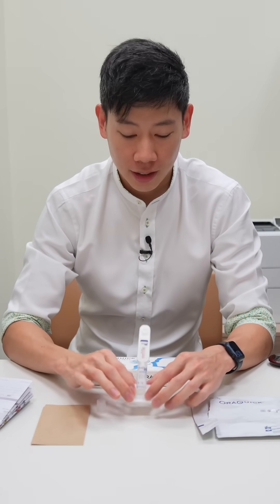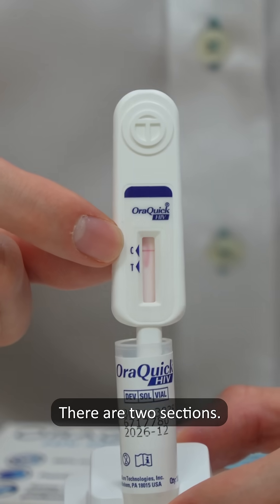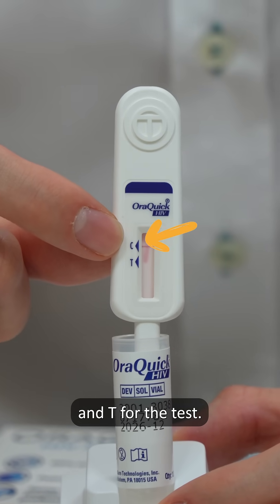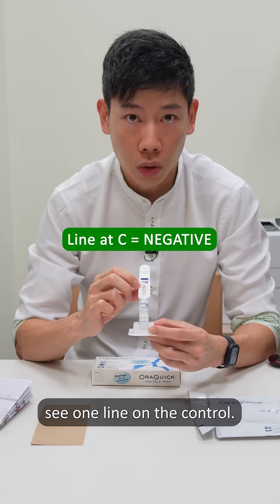Here's how you interpret the test. Like the COVID-19 test kits you're all familiar with, there are two sections: one is C for control, and T for the test. So after 20 minutes, you should at least see one line on the control.